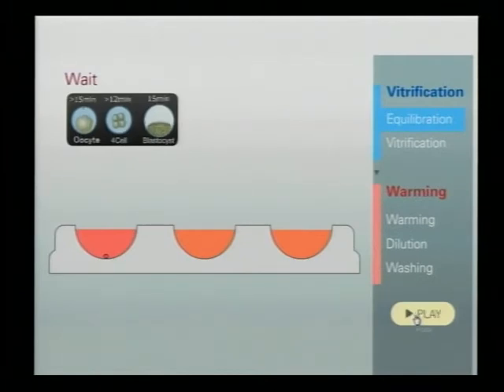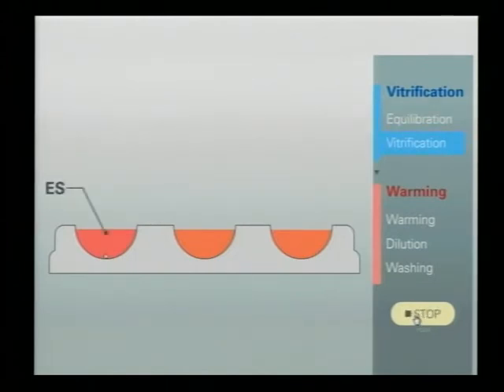And wait, wait for the recovery. The end of this step is decided by the time. First, very carefully observe volume. Before the incubation it shrinks and recovers. When recovery was completed, it is the end of this step. If the recovery is observed, you confirm the recovery 10 minutes, you stop, you complete this step, then you go to the next step.